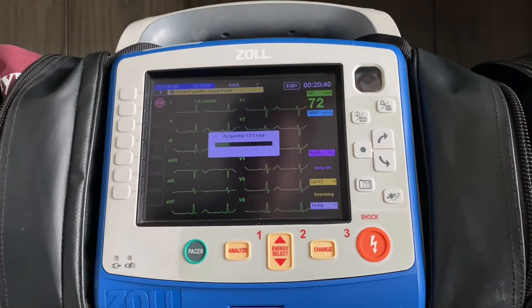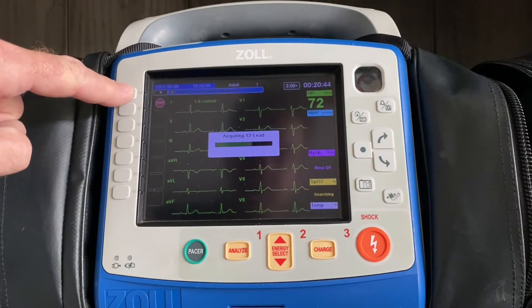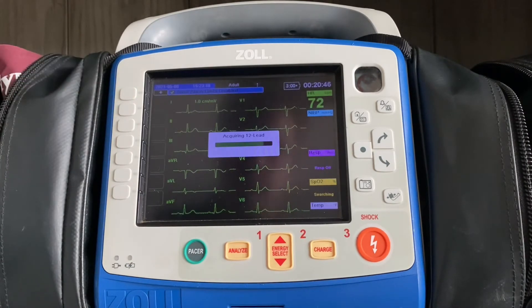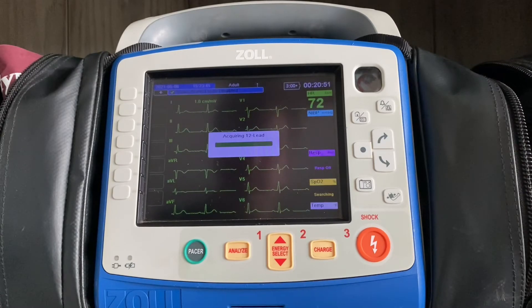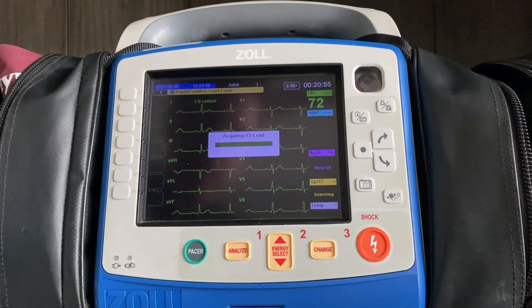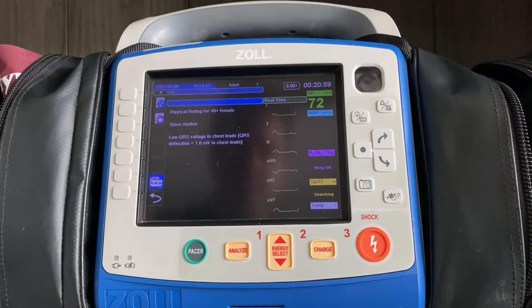Now, if you look at this screen and you say this does not look good, you can press the stop sign at any point, and that will stop the acquisition altogether so you don't have to wait for what you know is not going to be a good 12-lead to print out. The 12-lead will acquire, and then on the left-hand side of the screen it's going to provide your interpretive statement, and the 12-lead will start to print out.